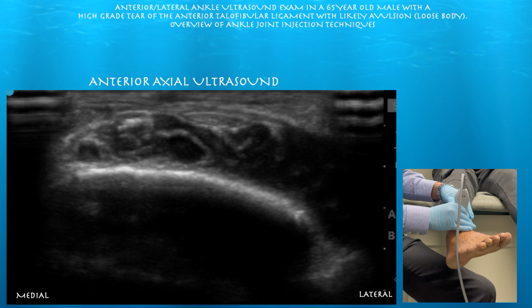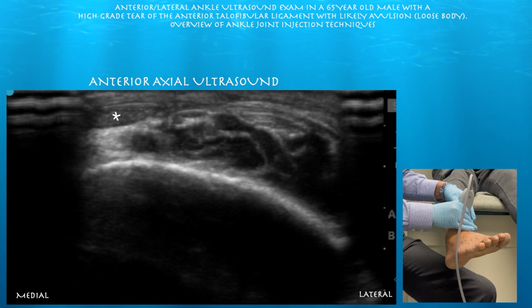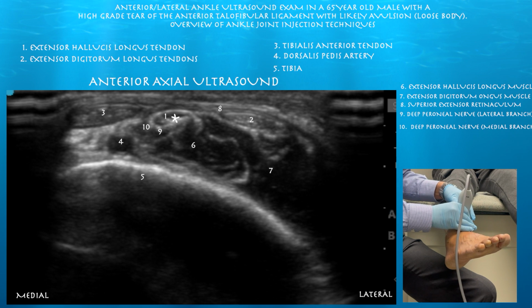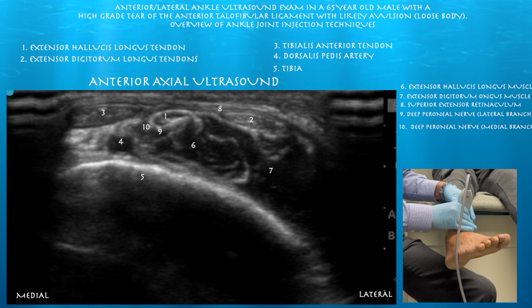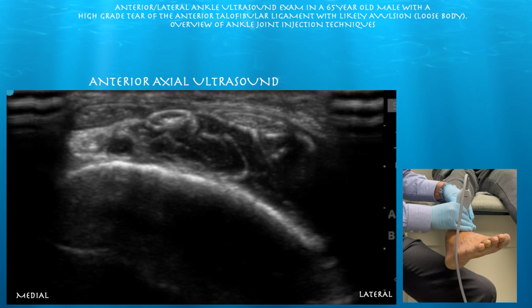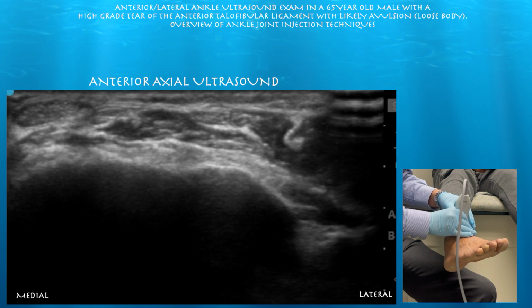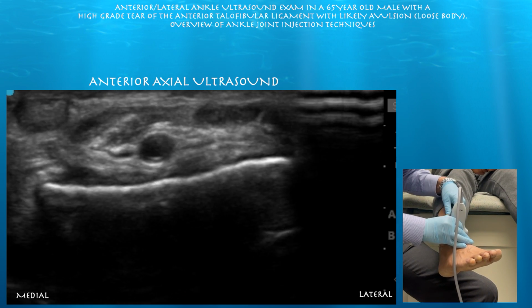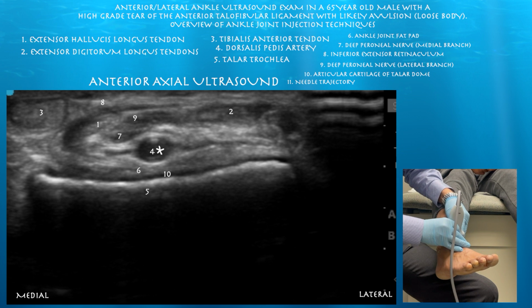Now we're going to look at the ankle joint in an axial plane. You can appreciate the dorsalis pedis artery pulsating underneath that tibialis anterior tendon, kind of between the tibialis anterior and the extensor hallucis longus tendon. Also, I believe you can make out the different branches of the deep peroneal nerve here, just under the extensor hallucis longus tendon. Now we're going a little bit distally towards the ankle joint itself, and now we're looking at the talar dome, or the trochlea of the talus. And here you can appreciate again the dorsalis pedis artery.